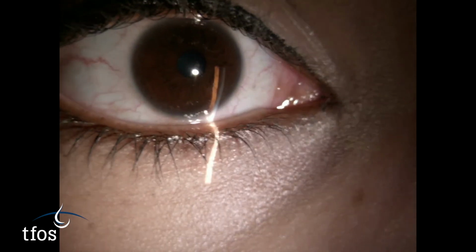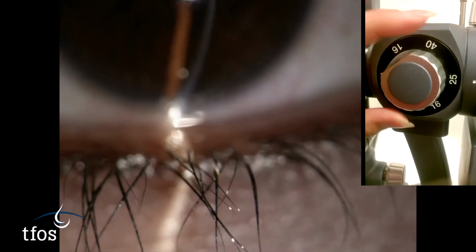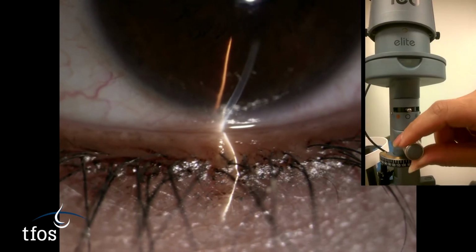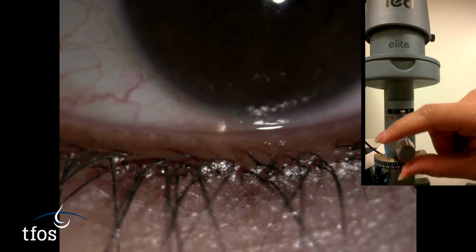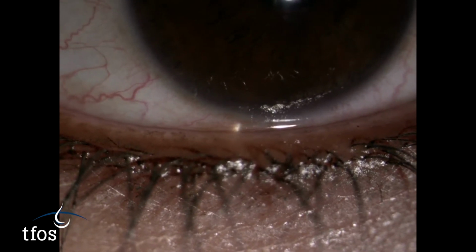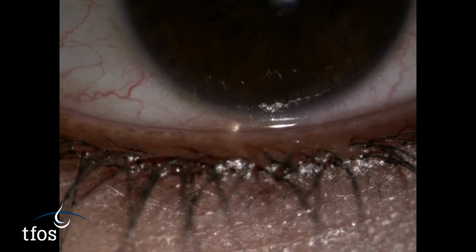Adjust the height of the slit beam to its smallest setting, typically around 0.3 mm, as this will be used as a comparator. This is done as the slit lamp beam width is rarely well calibrated. Note, this method provides an estimation of the tear meniscus height rather than an accurate quantification. Again, pay attention to the quality of the tear meniscus as well as its height.